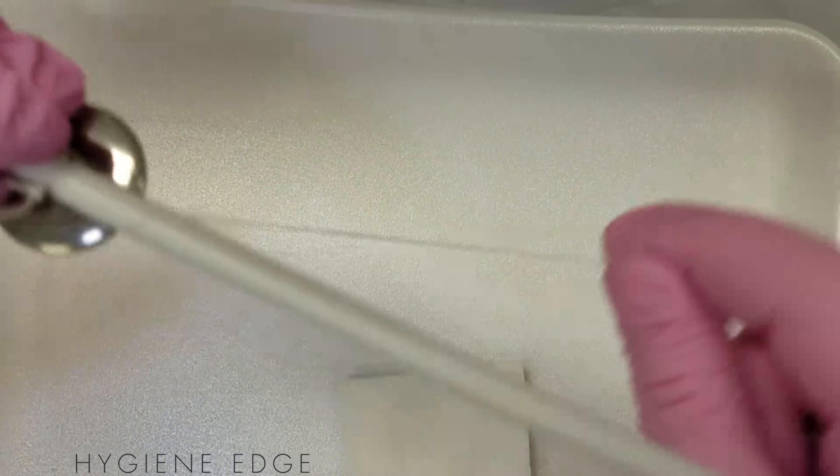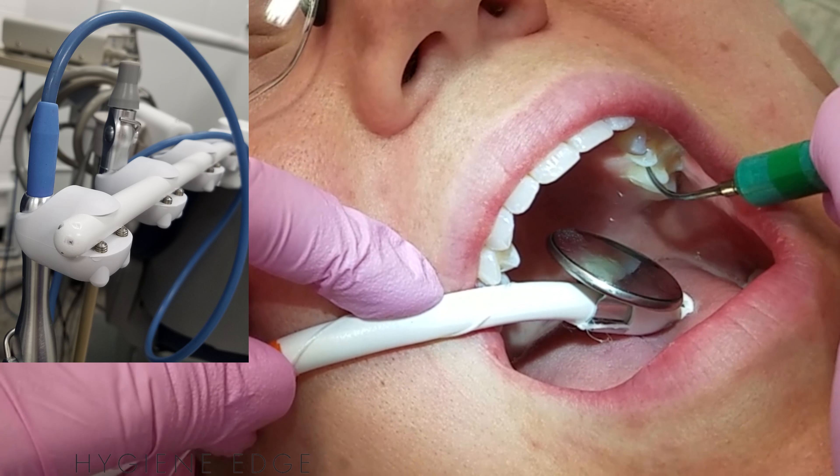You just thread a piece of floss through the loop, then circle it around the suction, and then tape it on with sterilization tape.